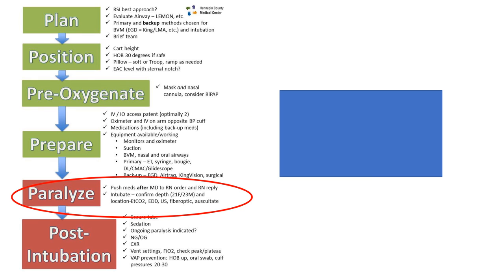Now it's time to do the procedure. You just recap the plan ABC for your team. You give the drugs, and then you assess the airway and do your intubation with the video laryngoscope technique. You get into the airway and you place the tube, and you see that there is end-tidal CO2, and everyone is happy. You do your post intubation measurements, and you remember that you cannot let go of the stress on the team right now. You need to make sure that the patient is being monitored properly and then treated. This is how the case could have gone.